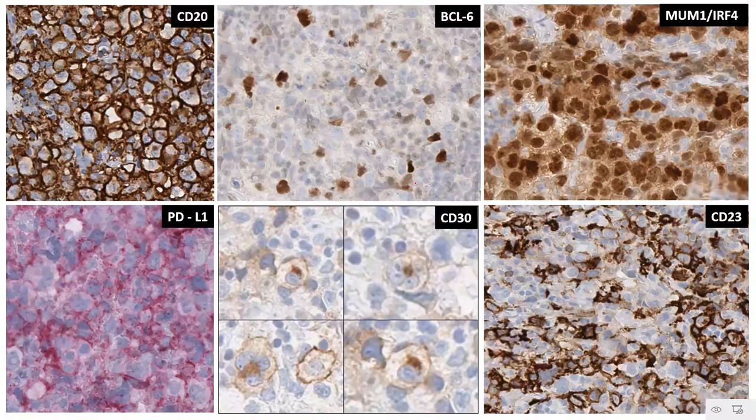What about the immunophenotype of these cases of primary mediastinal large B-cell lymphoma? Like I said, these belong to the large B-cell lymphoma category. So these will be naturally strongly positive for CD20 as well as the other mature B-cell markers, including the transcription factors for B-cell lineage like your OCT2, BOB1, etc. Now, as far as the BCL6 is concerned, some of these cells will show nuclear expression of BCL6. IRF4, that is a post-germinal center marker, we said that it is positive in the case of classic Hodgkin lymphoma. However, IRF4 is also expressed in the case of primary mediastinal large B-cell lymphoma.